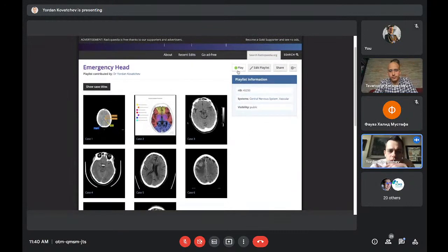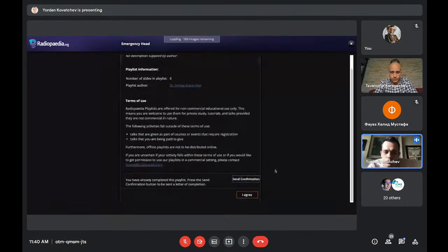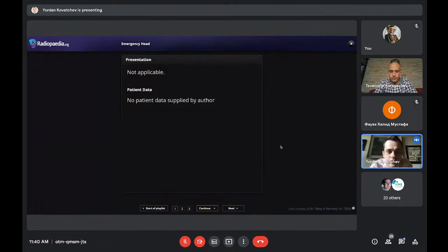So I sent you the link to this playlist. You can look at it now, you can look at it later, it will be saved. You can just scroll to the CTs to get a feel of what it's like to look at a head CT. We do this every day, really tens of times.